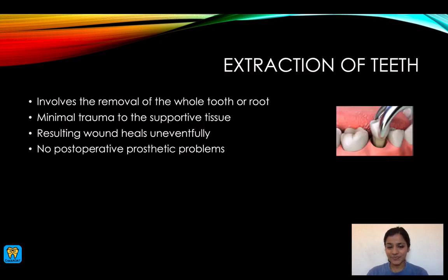So let's begin. So before we start, as usual, like everything, I want to give an overview first, and then I'm going to delve deep into which instrument to use when, and the forces to apply on which tooth, and so on. So extraction of teeth.